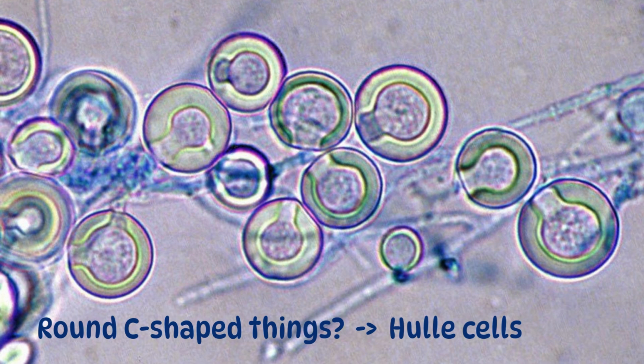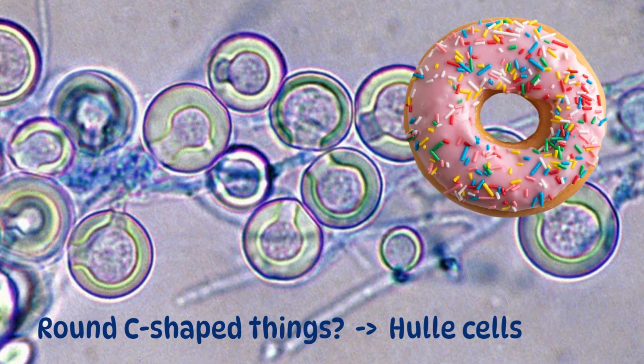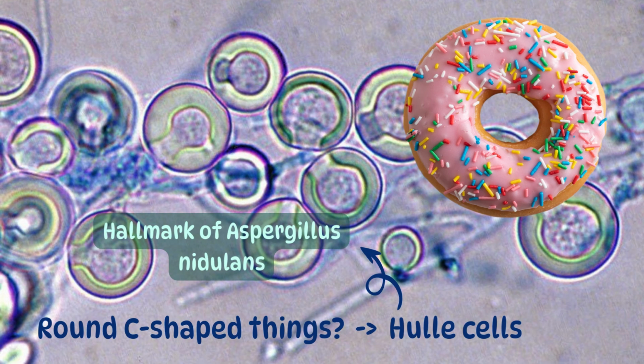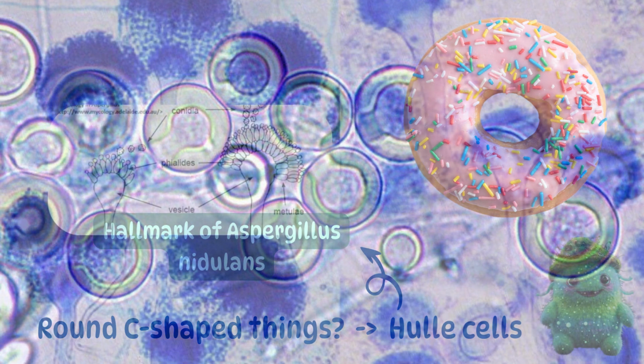To help us over this obstacle, I've found it helpful to match each organism's microscopic to something more familiar, give it personality, and then attach this to the name. We're going to use this approach before breaking down some of the features. At the end, we look for particular hallmarks for each organism that distinguish them from their neighbors.